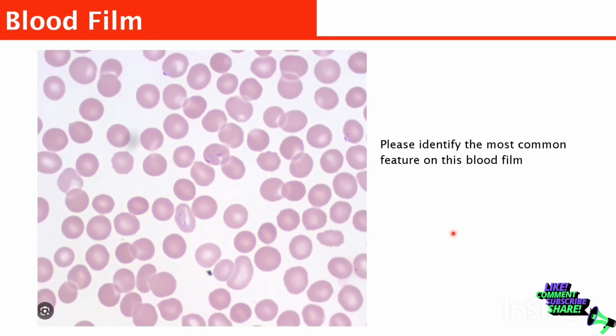But having said this, let me say something quickly. It is possible that there can be white blood cells on another field, but I think that it doesn't necessarily mean that we don't see. I'm sure that if you go to a different field, you might see one or two white blood cells or platelets, as the case may be. But this is one field I think we are looking at. Okay, but I think that in this interview, what they really want you to see is the presence of malaria parasite, and perhaps what you can do in terms of calculating parasitemia. Okay, now that is what I think this is talking about.